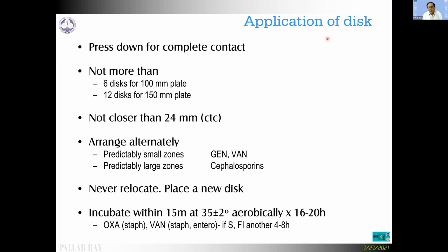When we apply the discs, some people find it more comfortable using a tweezer. Some people feel more comfortable using a needle. It's a personal choice. One should press down the disc for complete contact. Do not use more than 6 discs for a 100 millimeter plate, or more than 12 discs for a 150 millimeter plate. The discs should not be closer than 24 millimeters center to center. You can plan to arrange alternately the discs which have predictably small zones and predictably large zones.